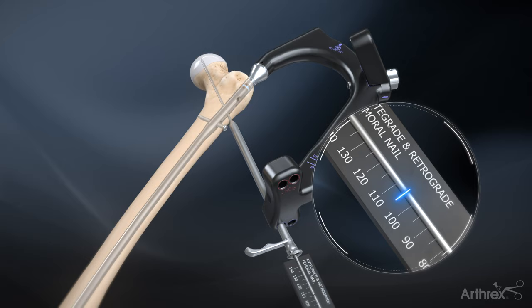Use the laser marking on the guide pin by sliding the guide pin depth gauge over the guide pin and reading the required screw length.